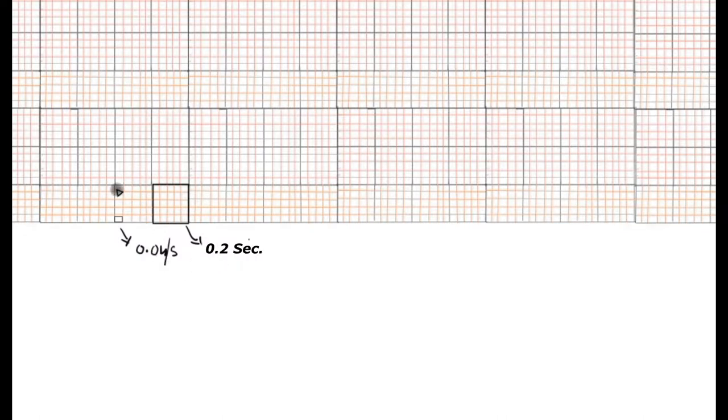The running ECG strip covers 1 second with 5 large squares. So 5 large squares are covered by 1 second, or 5×5 = 25 small squares being covered by 1 second.